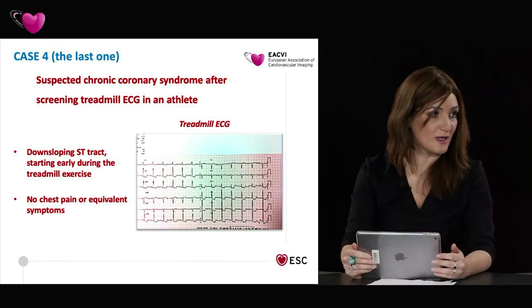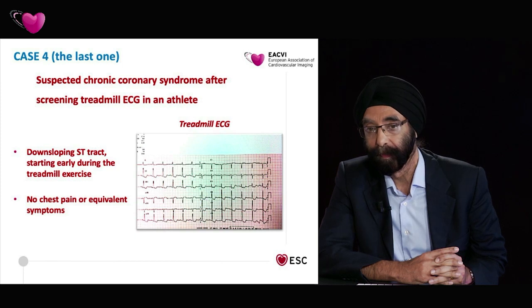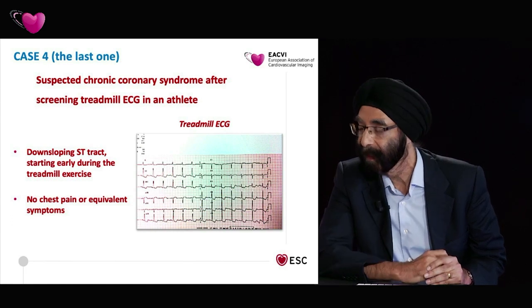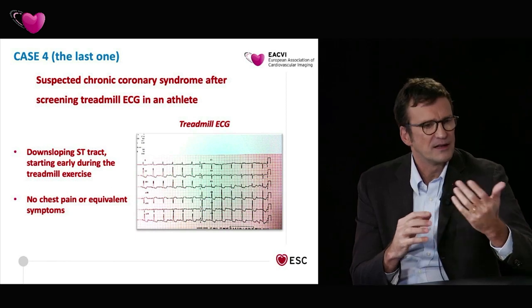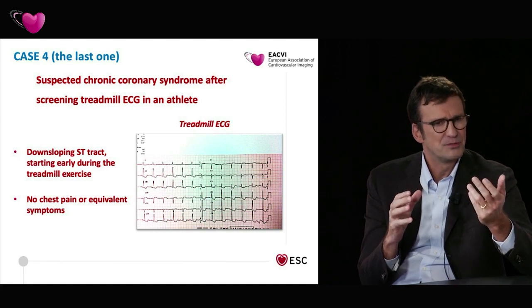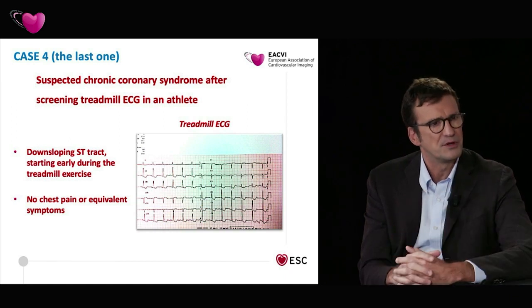Like 100 cases? Yes, I think so. My instinct was at least 100 cases, to be aware of the pitfalls and to actually do it yourself to really get an understanding of the technical difficulties. Yeah, sure. It has the same problems that you can find in CMR or other types of imaging with artifacts. The additional problem is that you need to put your hands on the machine to be able to correct them and build personal experience.